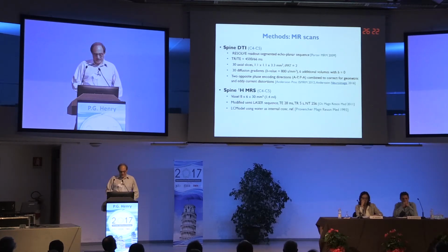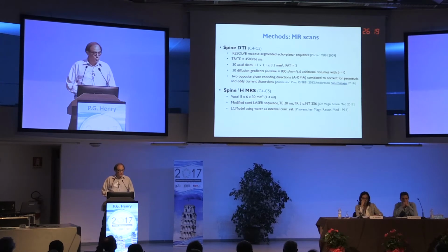And finally, the spine spectroscopy was done in a 1.4 milliliter voxel with a semi-LASER sequence, echo time 28 milliseconds, and 256 acquisitions, and using LCModel to analyze the spectra using water as an internal reference.